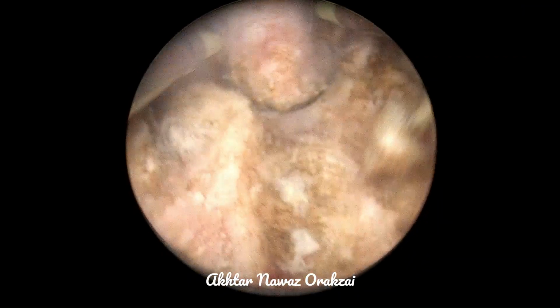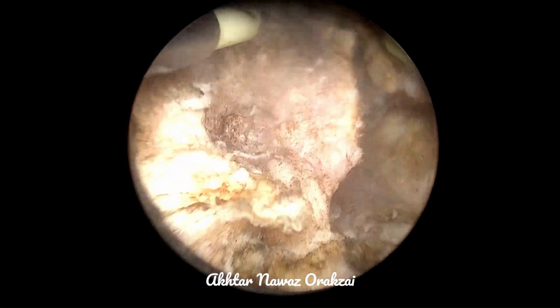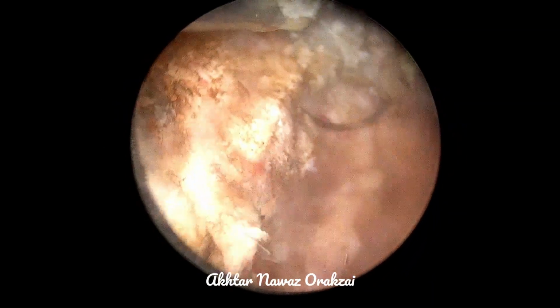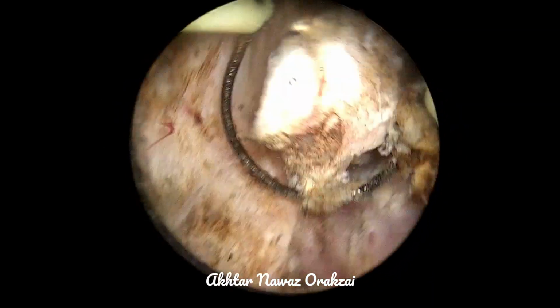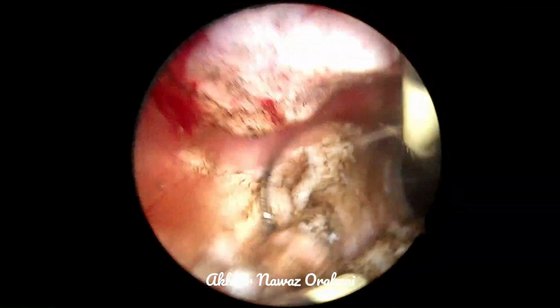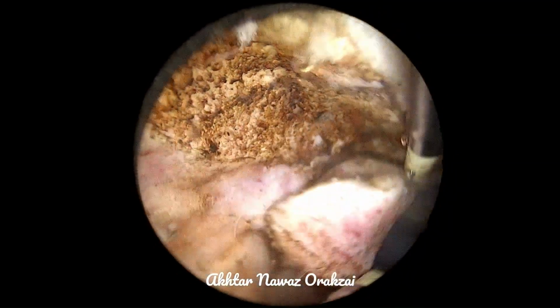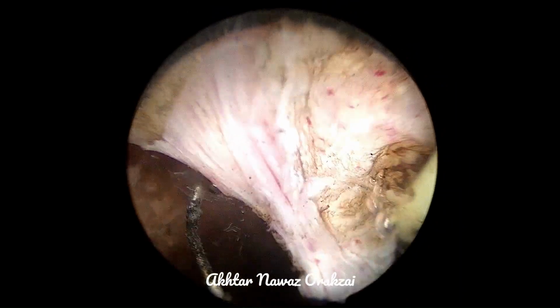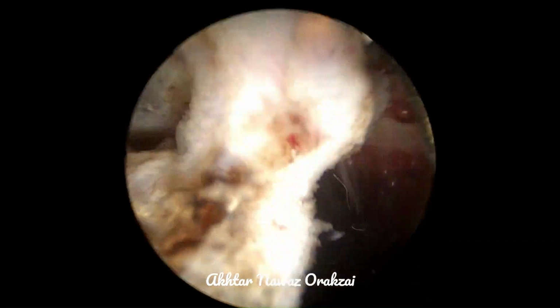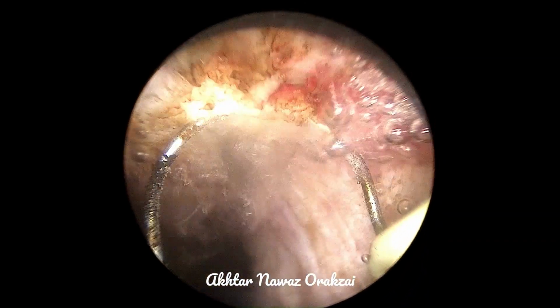So after seeing the black dots, one must be careful taking deep chips, because taking a deeper chip may lead to contraction of the muscle fibers in the prostatic capsule, because of the activation by the diathermy. They contract, and the capsule comes onto the resecting loop rather than the resecting loop going into the capsule. So this may lead to breaching of the capsule. So one must be really careful.